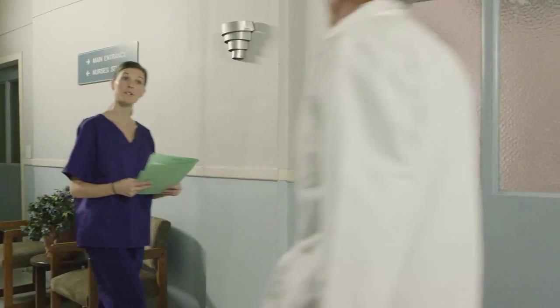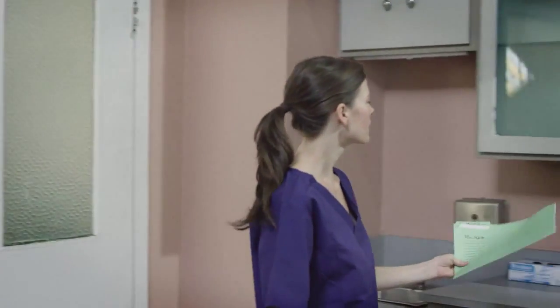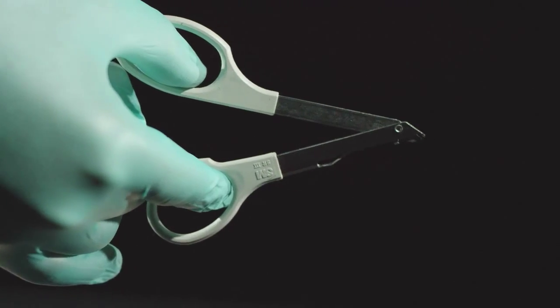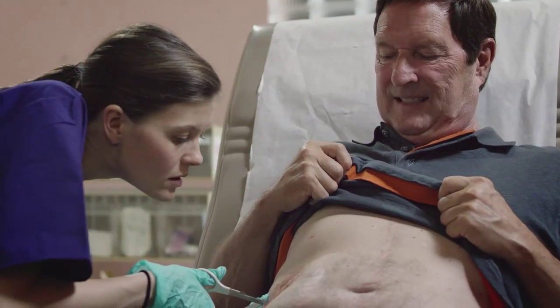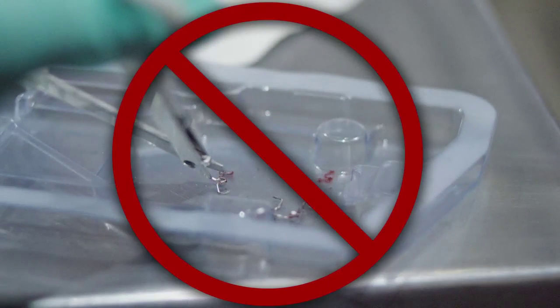After seven to ten days, it's time to remove staples. But the doctor doesn't usually do this procedure — it's the job of the physician's assistant or nurse. In this case, Linda. The current process of removing surgical staples uses a scissor-lifting device like this. When a healthcare worker removes the staples, they must deform each staple individually, take their attention away from the room, and place it in an open container, like so. This is dangerous.